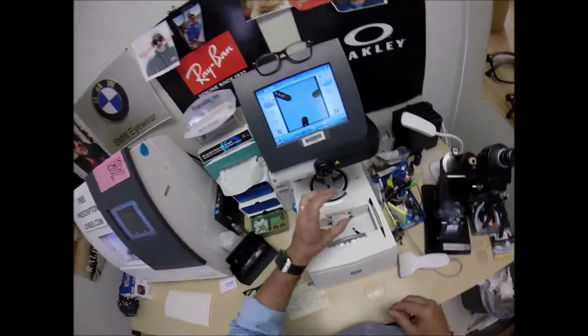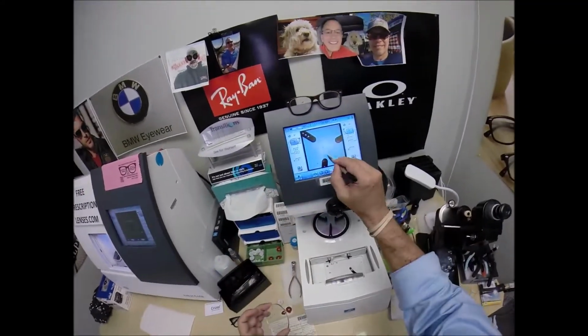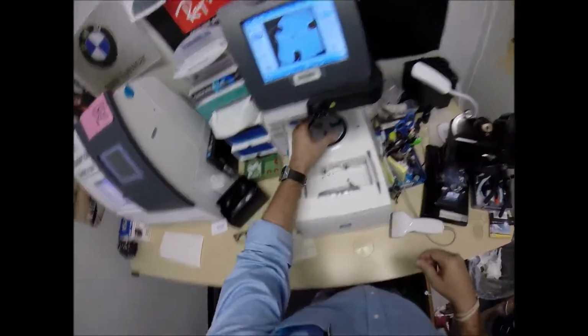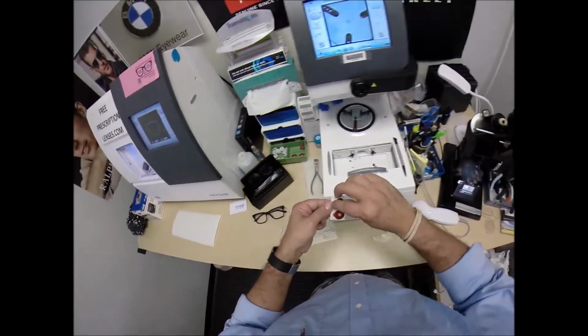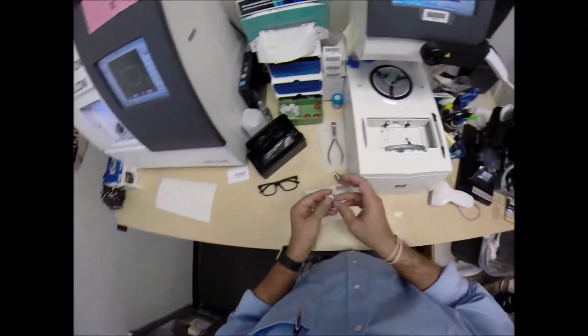So the reason I put these black dots on there, it tells me the lens is oriented in there just perfectly. That blue cross is the geometric center of your frame. Your eye is just above that in inset. So this is a block, or as I like to call it, Jenny from the block. I need to attach this to your lens while it is cutting. So I need 2 double-sided adhesive stickers, of which I've got 2 right here.